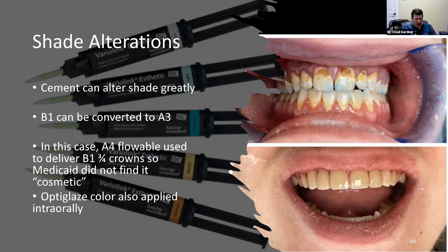But if you thin it back, the color shows through. So if you have to print it 1.25, maybe 1.5 millimeters thick, if you can get away with that, depending on the shape and whatnot. But for this young fellow, I do remember I printed those at 0.75 millimeters thick, which was under the manufacturer's recommended, but it was for purposes of getting the proper shape.